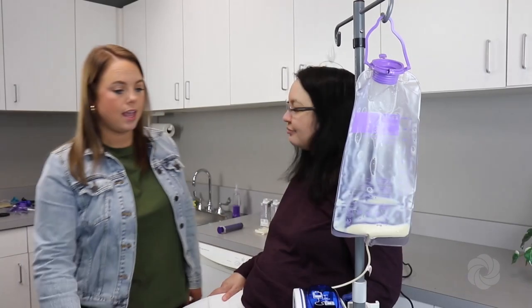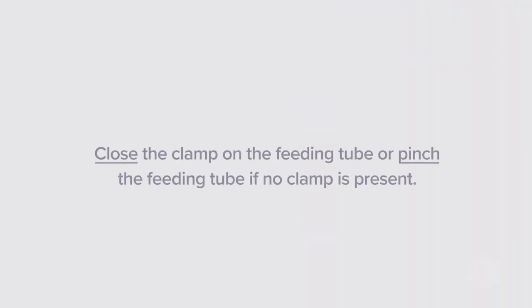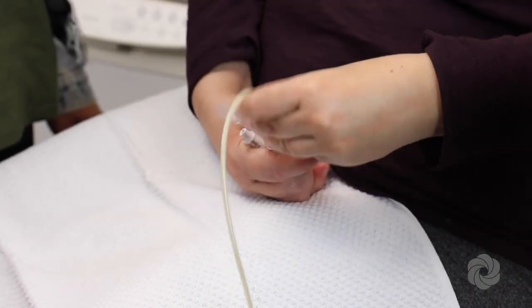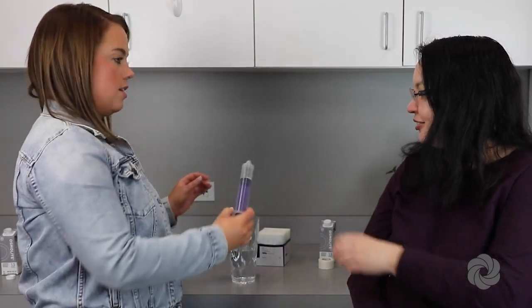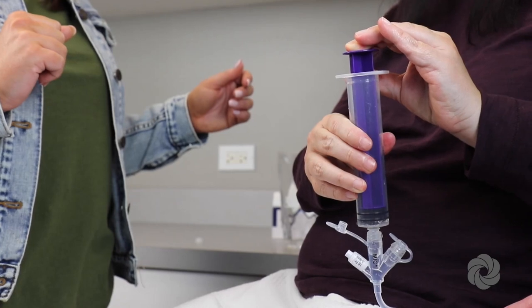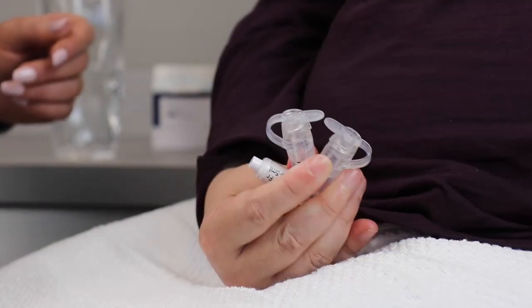Once the feeding is complete, push power down. Then close the clamp on the feeding tube, or pinch the feeding tube if no clamp is present. Disconnect the feeding bag from the feeding tube and flush the feeding tube with water if prescribed on your tube feeding order. Close the cap at the end of the feeding tube.